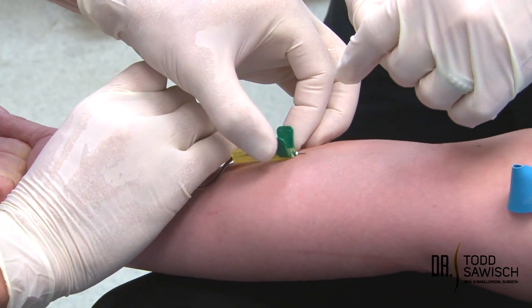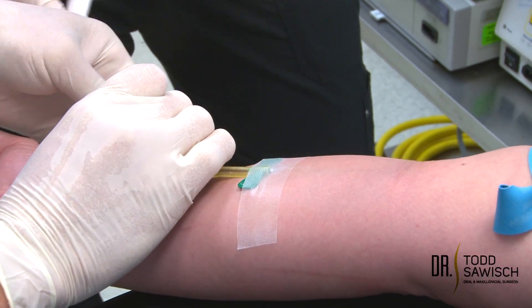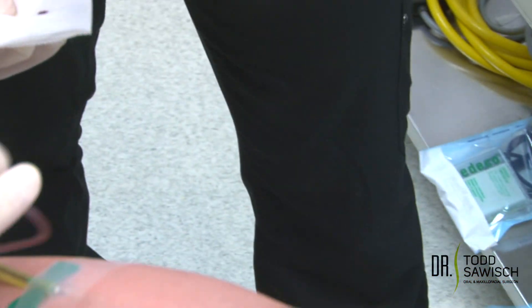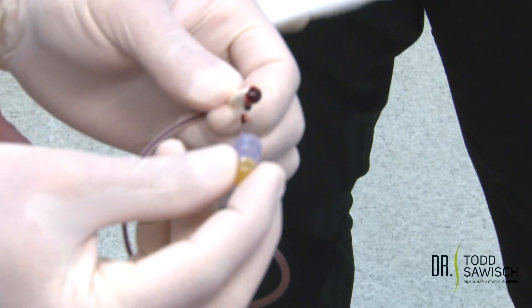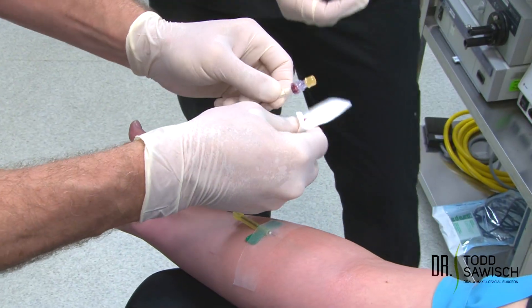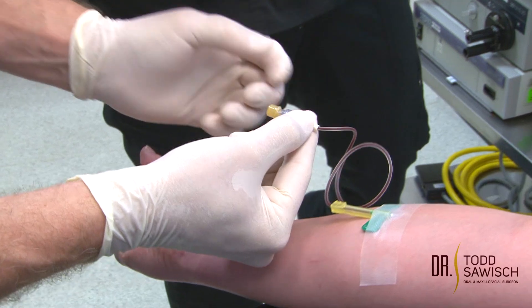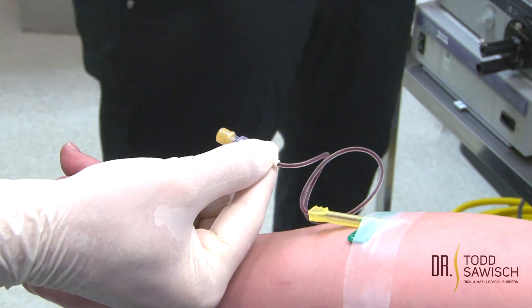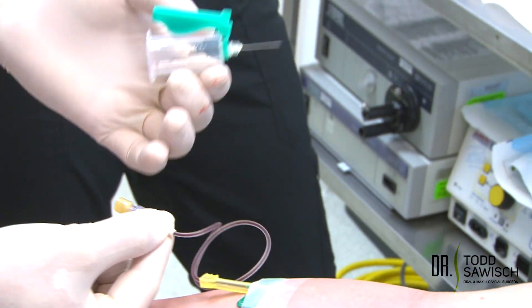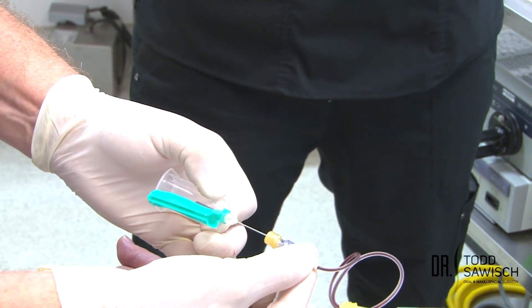My assistant is going to go ahead and put tape on there to secure it. You can see we got the flashback through the tube. We're going to put on what we call the adapter button — sometimes it will bleed, that's okay. We're going to cleanse this area and support the needle.